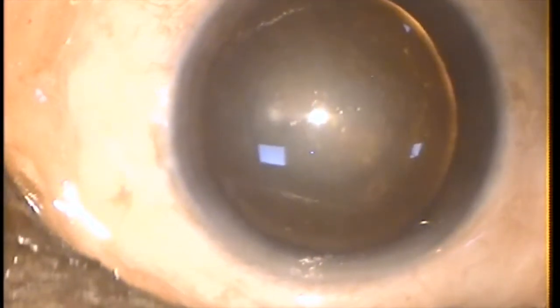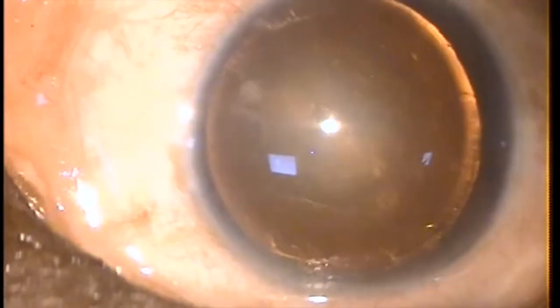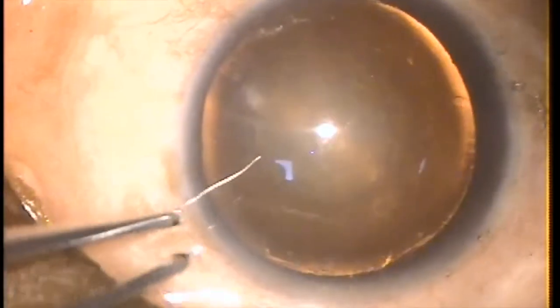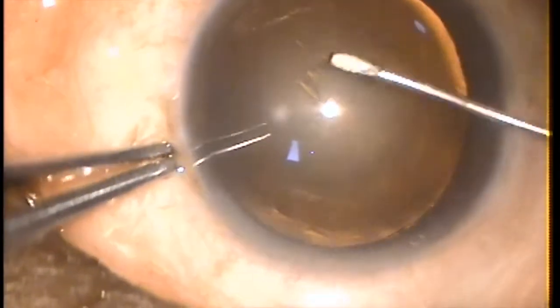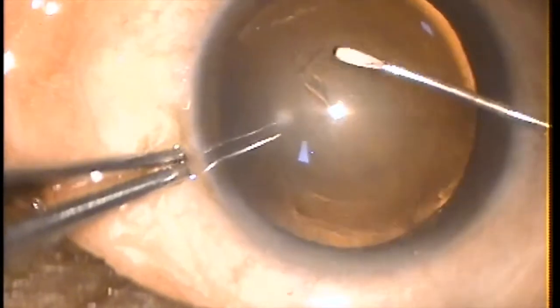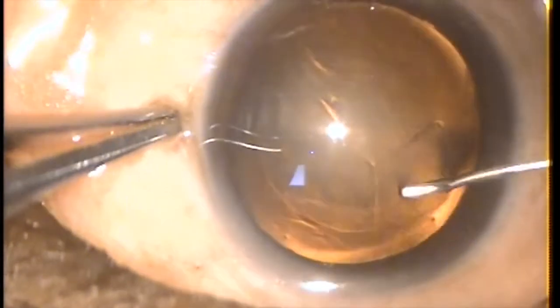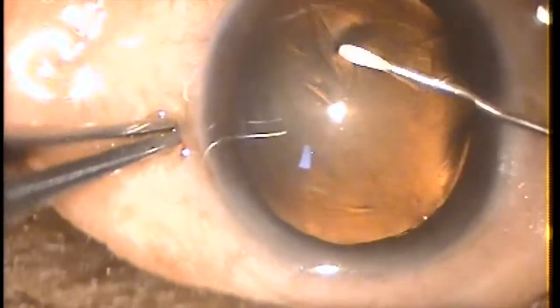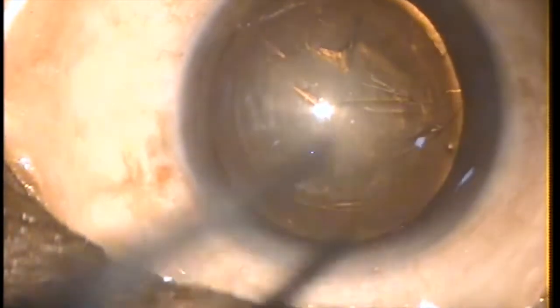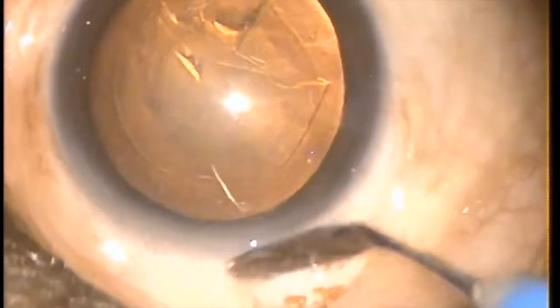There is a good red reflex glow, so the capsule does not need to be stained. Viscoelastic is injected, and by pushing the eyeball, good retroillumination is achieved. The CCC is done by lifting the anterior capsule, making a nick, and going circularly. All steps are performed topically and the patient experiences no pain. The capsular edge is round, central, and equidistant from the margins. The conjunctival peritomy is done using a crescent blade instead of scissors, ensuring minimal dissection and less bleeding.